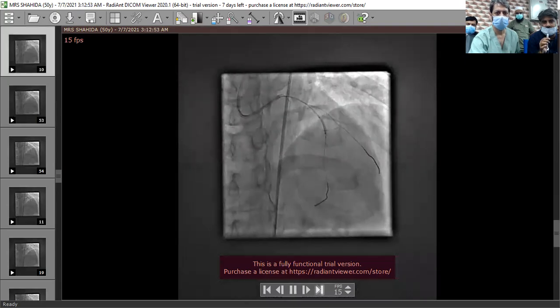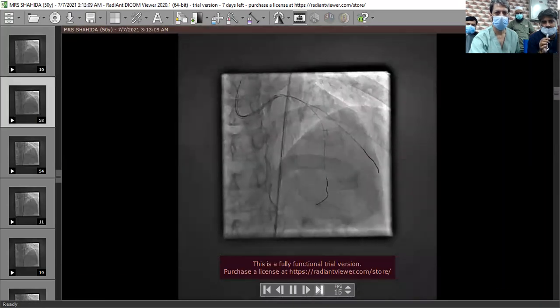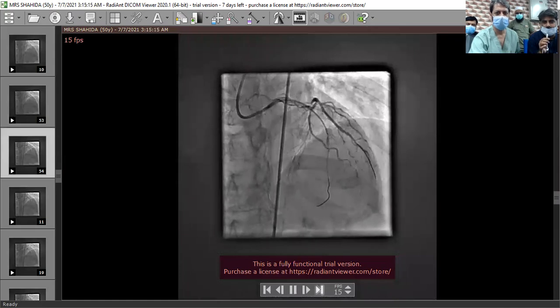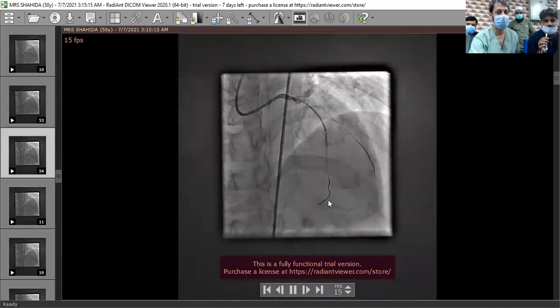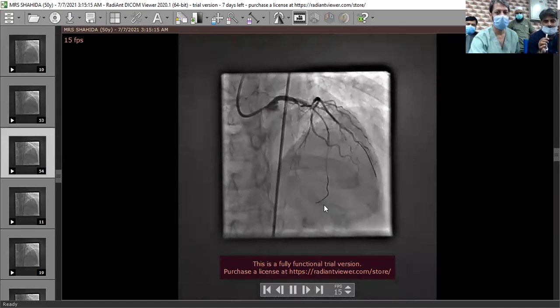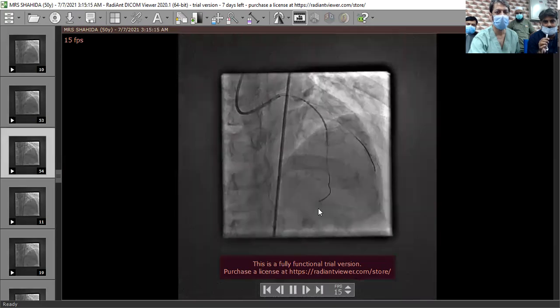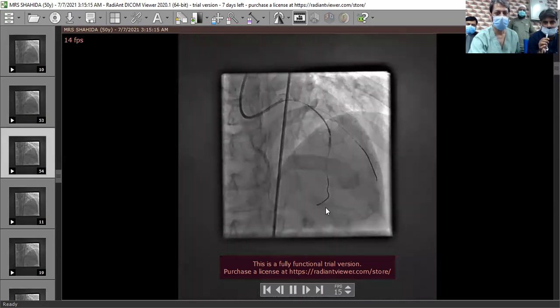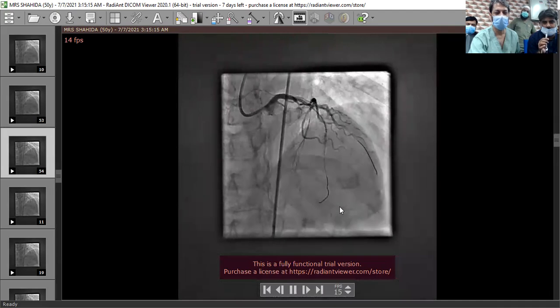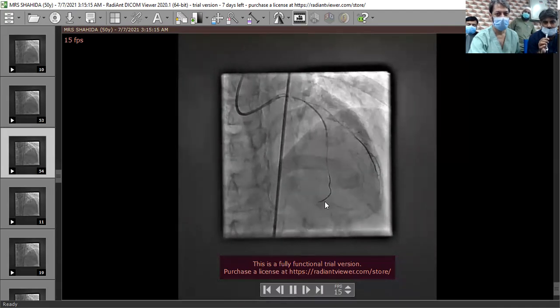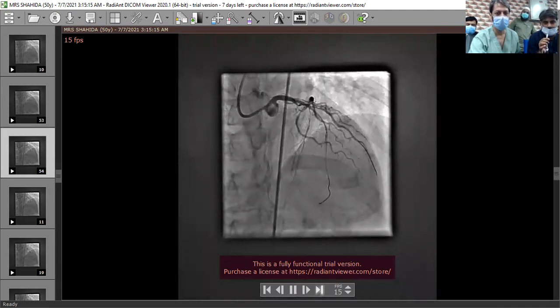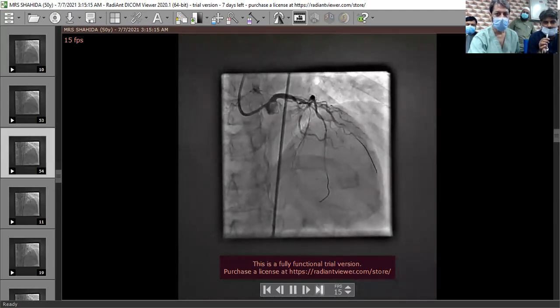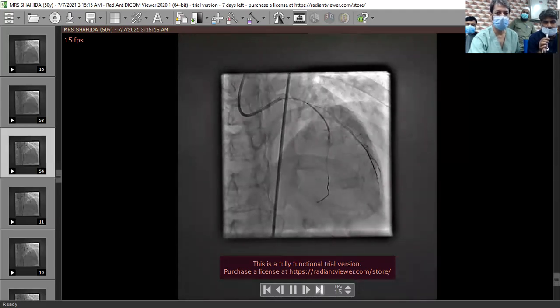That is your pre-dilatation. However, the distal wire is not rightly placed — it is in a small branch. You must be very careful when doing acute interventions, as a lot of anticoagulant is on board. The wire should be in its right place rather than in a small branch. Now you are putting a stent — what is the size?